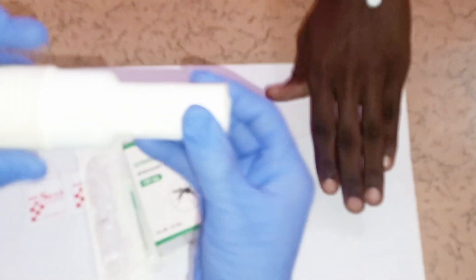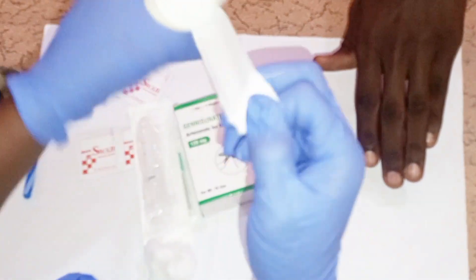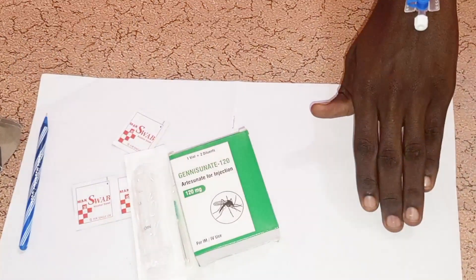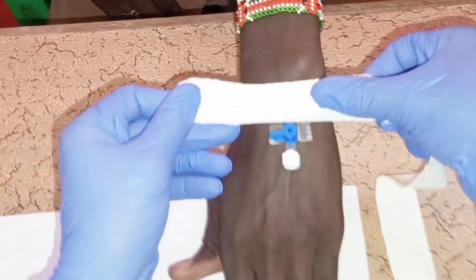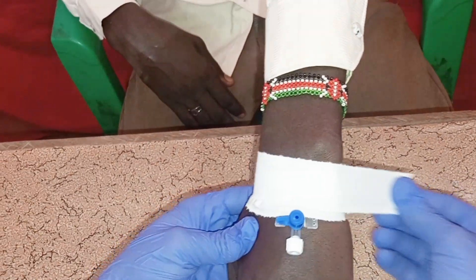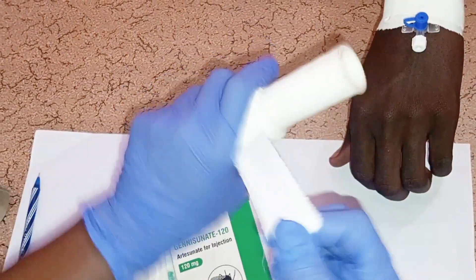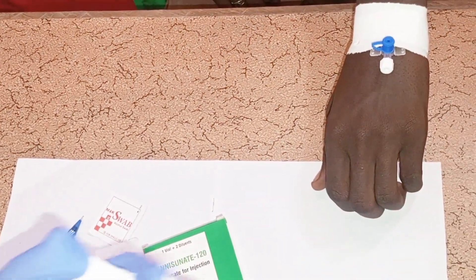Now dress and secure the cannula. Start by dressing it first, then get another piece of adhesive plaster to adequately secure the cannula before you start administering the drug to the patient.